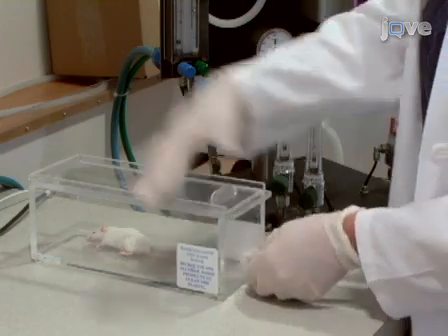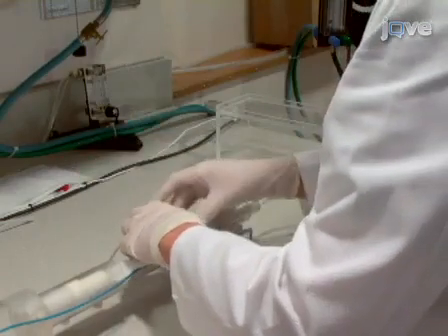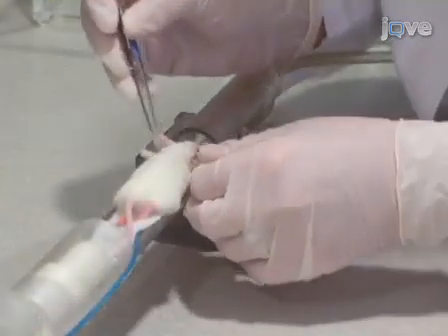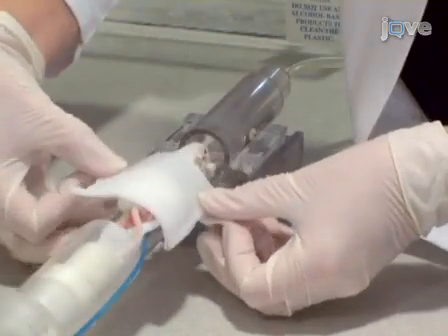Once fully anesthetized, remove the animal from the chamber and place it into the stereotactic holder equipped to monitor breath rate and temperature. Place the animal's head into the head holder, secure the ear bars and tape the body with gauze.